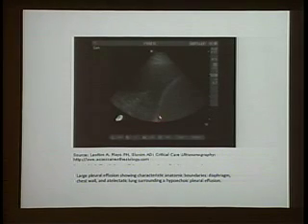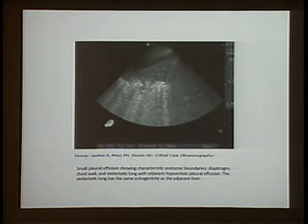Again, it's a little bit clear, but you see the diaphragm here. There's probably the liver here, and you see this dark area surrounding this structure here. Normally, the lung doesn't transmit ultrasound, but this image suggests that this lung is consolidated or atelectatic, and is surrounded by fluid all around. Again, very easy, and I'm going to show you better images in a second.